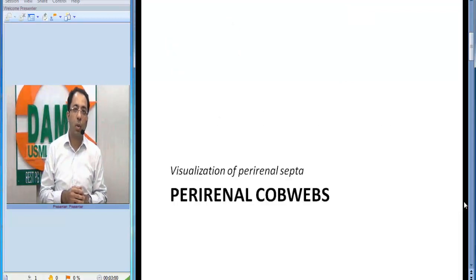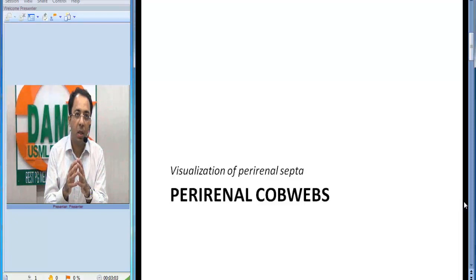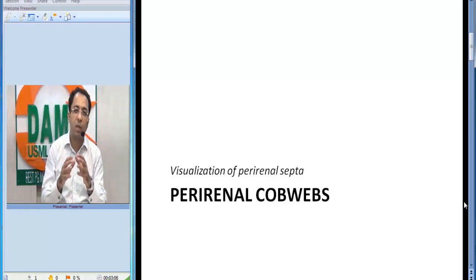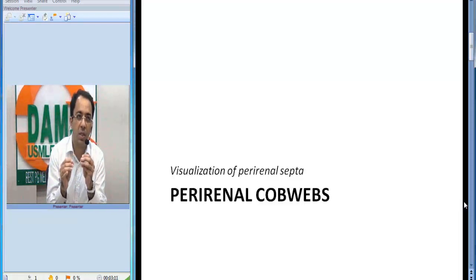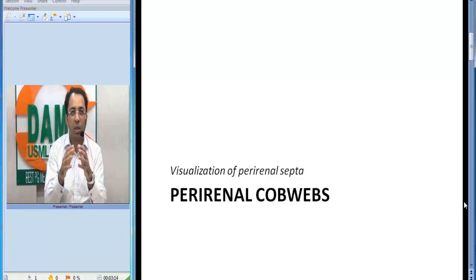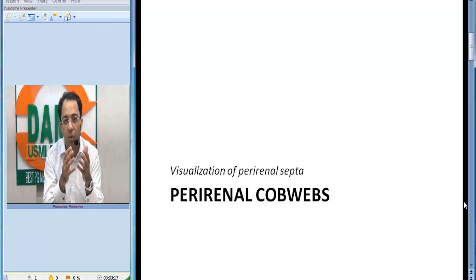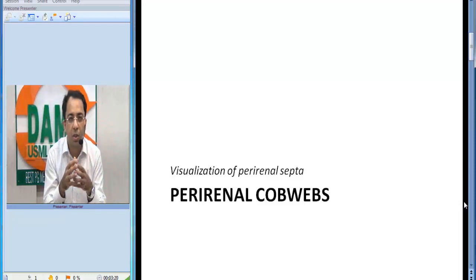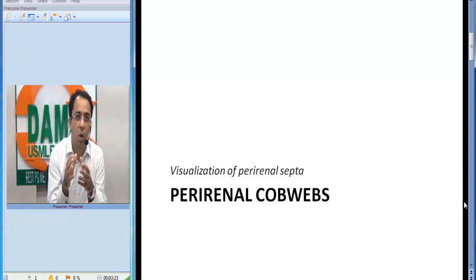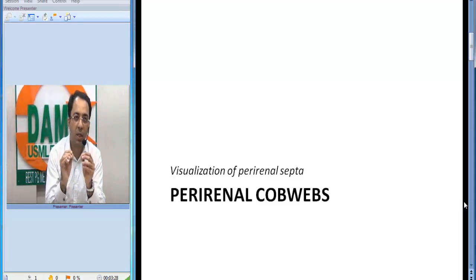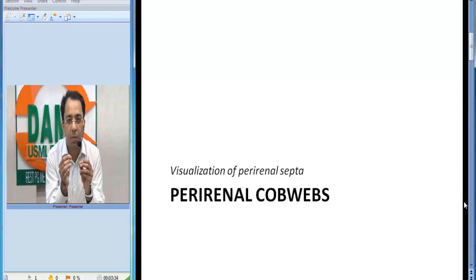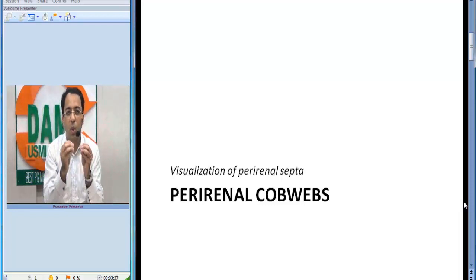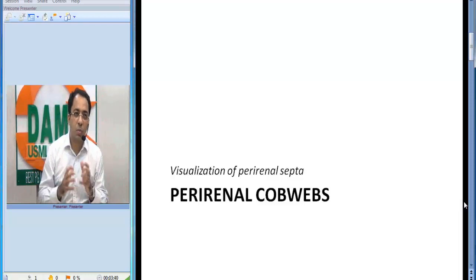The first sign I want to discuss is perirenal cobwebs. This sign was initially described for renal vein thrombosis — in patients with renal vein thrombosis, you could visualize the perirenal septae in the fascia, and they resembled cobwebs. Initially people thought they were collaterals. With advances in technology, we now know these are very commonly seen in patients with acute ureteric obstruction, and these perirenal septae probably represent edema, back pressure changes, or some extravasation.